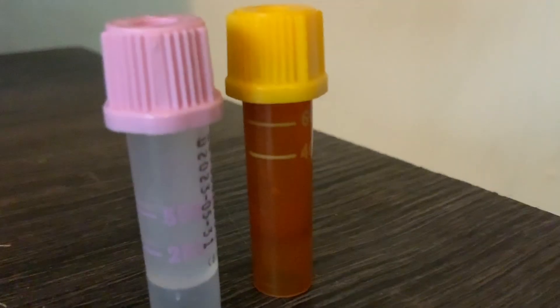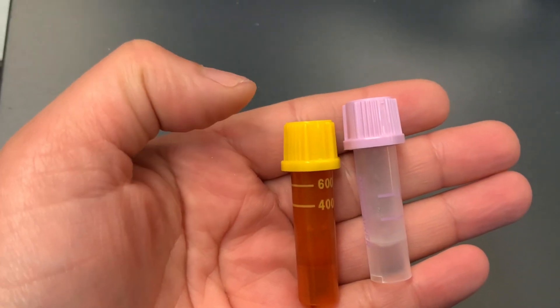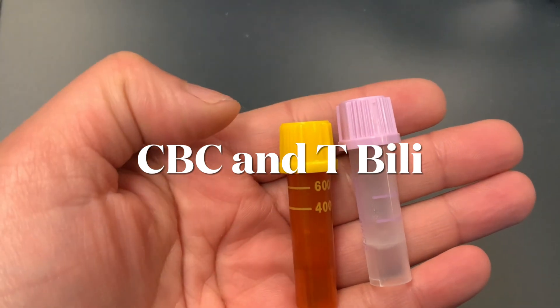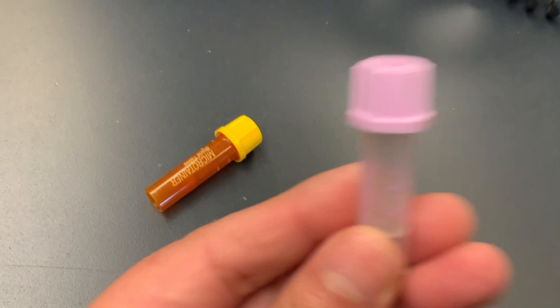Let's talk about capillary tests. When you have to draw those mini pediatric tubes, let's pretend you have to draw a CBC and maybe a bilirubin on a baby — you always draw the lavender first.